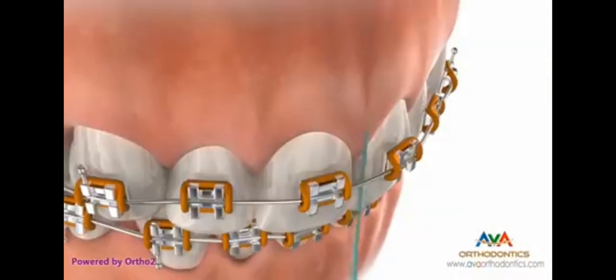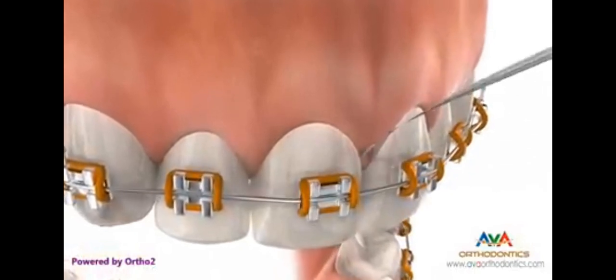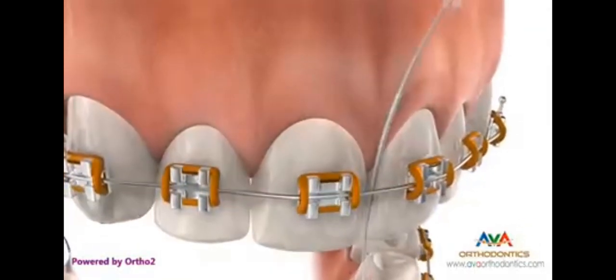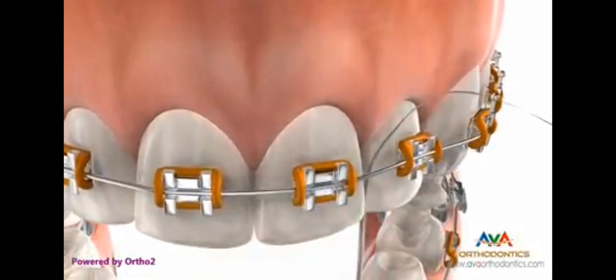Pass the floss and threader up between two teeth. Slide the floss back and forth several times, cleaning the surfaces of these teeth. Be sure to clean below the gum line.